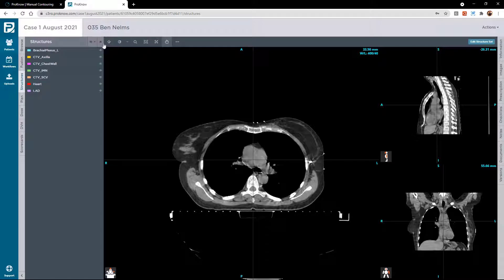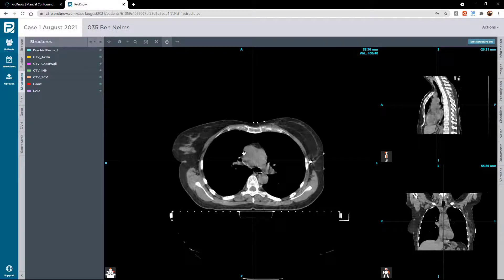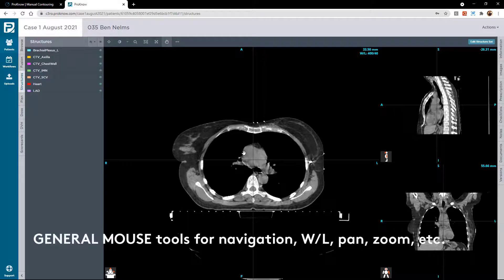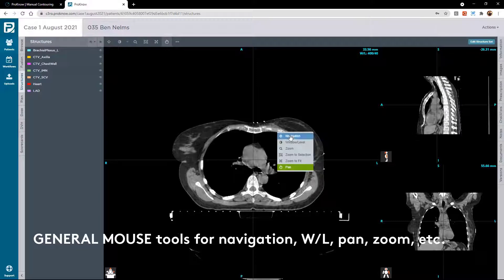You'll see that all of the structures are turned on. These are little eyeballs which toggle the structures on and off, but there aren't any contours yet — that's why you don't see anything. Let me show you some of the tools you can use. Before you contour, you're going to want to optimize your display. The mouse options are: navigation, window level, zoom, zoom to selection, zoom to fit, and pan. You can see I'm in the pan mode now — it's exactly what it says, you can move any of the views around. We have axial, sagittal, and coronal.